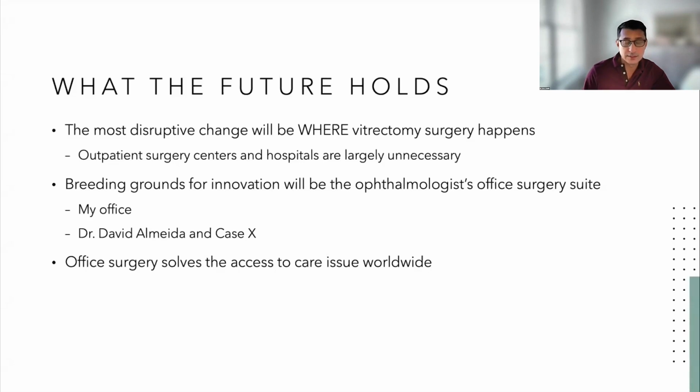And we're going to produce the safety data that shows we can do all kinds of complex retinal surgeries, in a very highly sterile environment, without the big cost of the construction of a hospital or a surgery center. And we can do it in the office, which keeps the surgeon where the patients are, where the clinic is. Very important. And that also gives breeding grounds for innovation, the way that I can collaborate with my team at Yale.